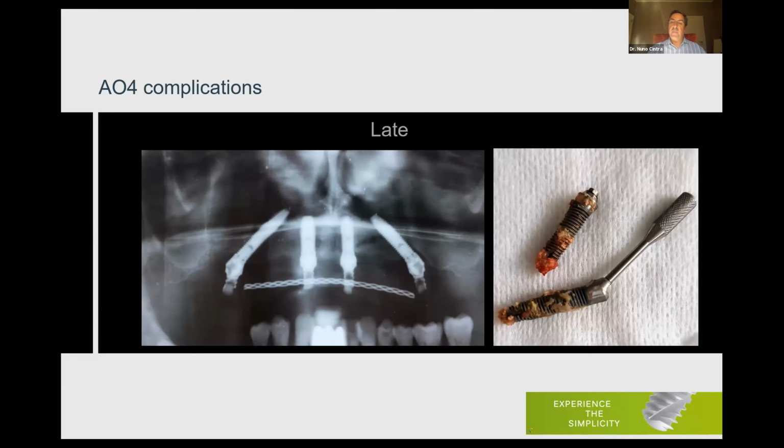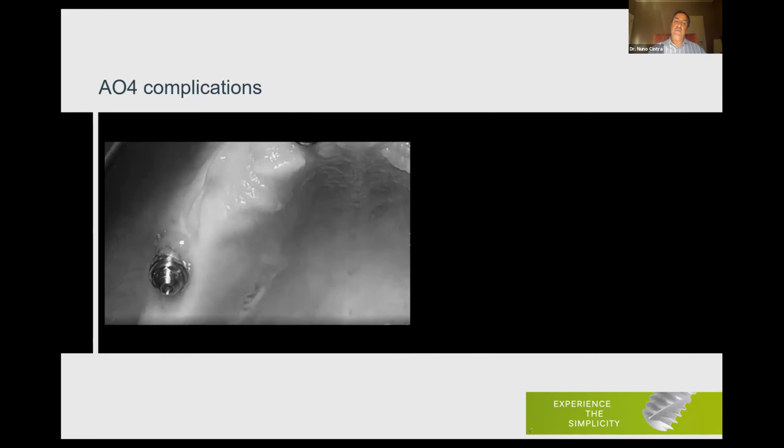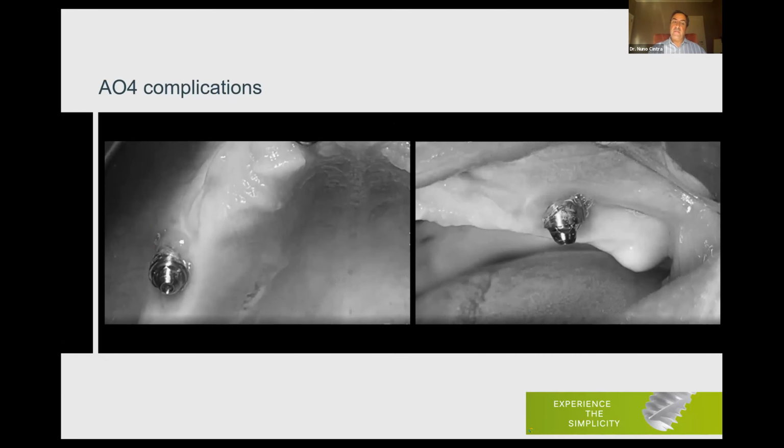That's another issue. Okay, but this protocol, this rehabilitation technique needs maintenance, and you should have a strict maintenance protocol. Another problem, sometimes we don't have keratinized tissue around the abutments, and this should be seen during surgery.